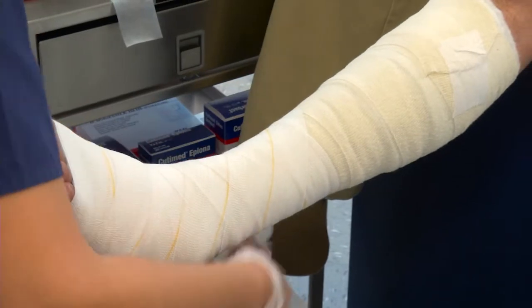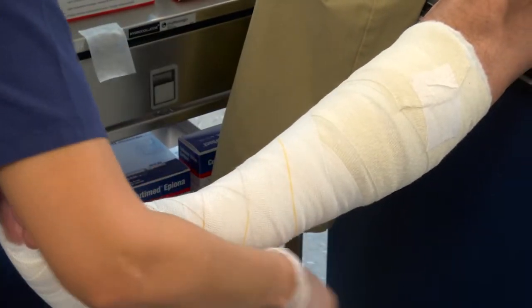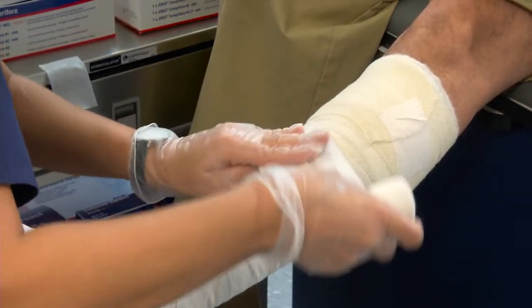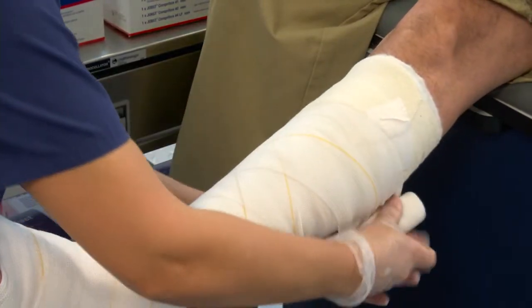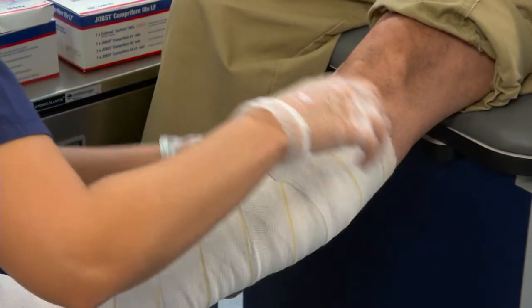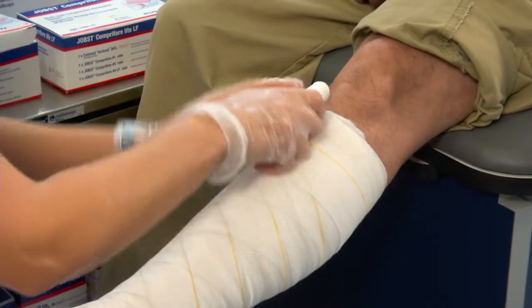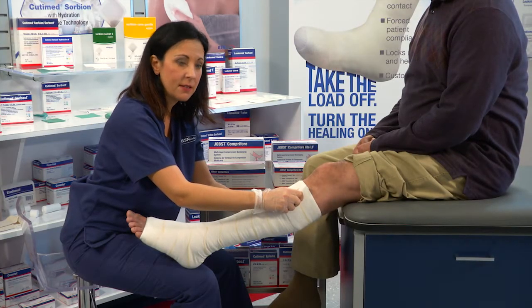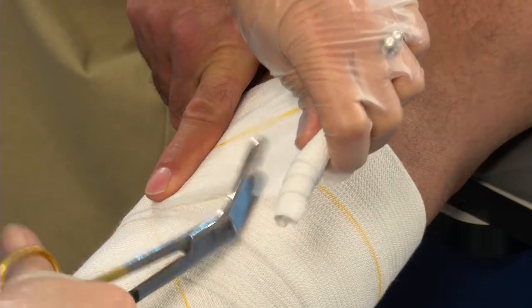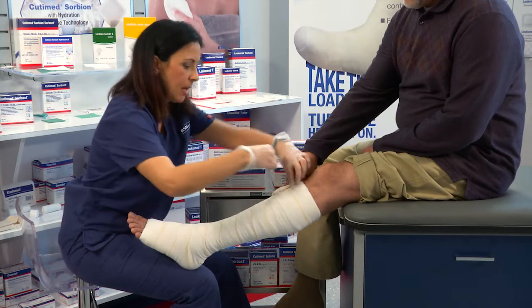We're going to continue with this figure of eight pattern up the leg. When we get to the top, you want to make sure you cut off any excess. You can ask your patient to hold the bandage in place while you do this. And you're going to use tape to secure it in place.